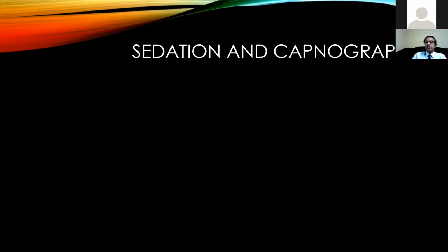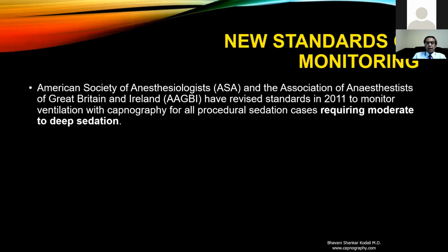Now, what about sedation and capnography? In about 2011, the ASA and the Association of Anaesthetists of Great Britain and Ireland revised their standards and included that capnography should be used to monitor patients during procedural sedation, particularly during moderate and deep sedation.